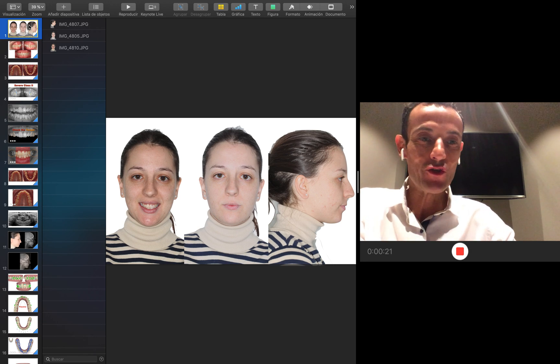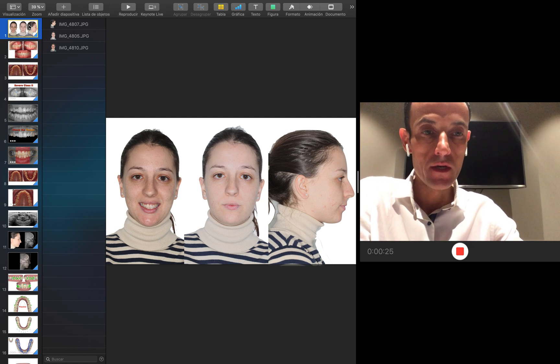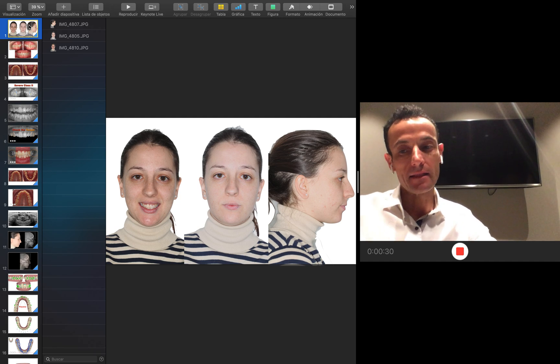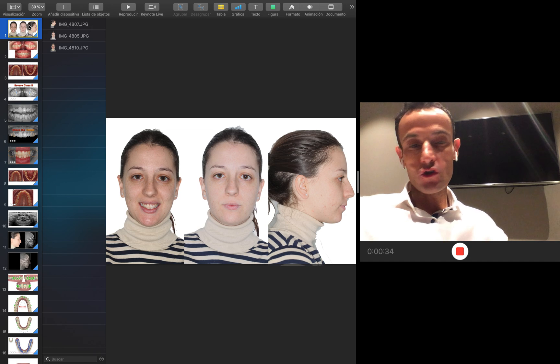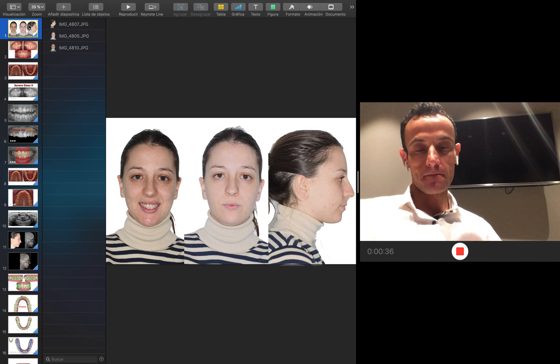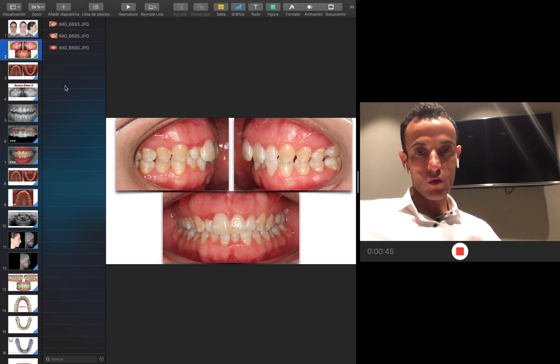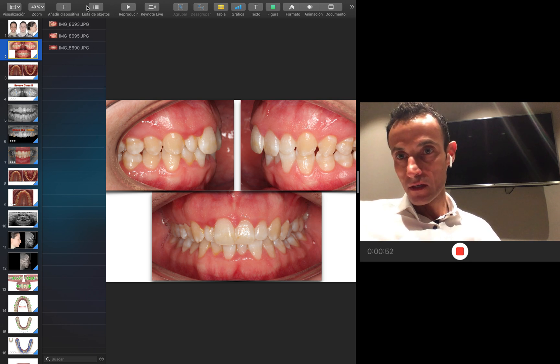Good morning everybody. I want to show you this clinical case where I'm going to show you a few tips on how you can solve a severe case with crowding, deep bite, and a Class II occlusion using my protocols — elastics, aligners, and screws. Look at this woman when she starts. You can see here how we have a bilateral Class II in both sides.